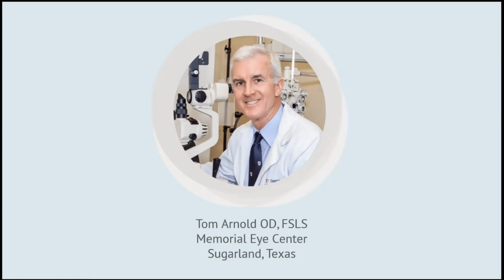We have to get over the cones, especially when they're peripheral, the pinguecula, we all struggle with. So these are big advancements, and anybody who's been fitting sclerals can understand how important this is. So kudos to you, and I am happy and flattered to be able to spread the word. And just like Tom said, I don't hold back. So any issues you're having, I'd like to take them up and address them.